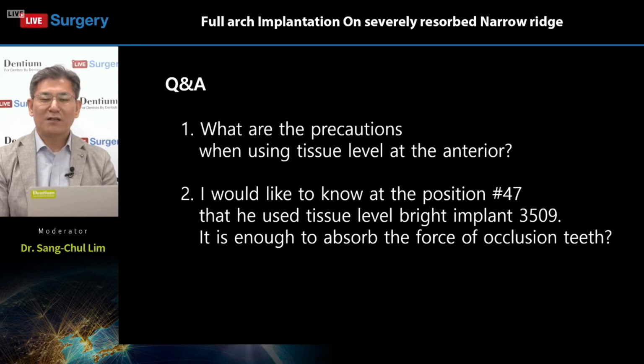Tissue level is a very good, useful and versatile implant fixture system, right? We have a wide consensus about this tissue level implant.